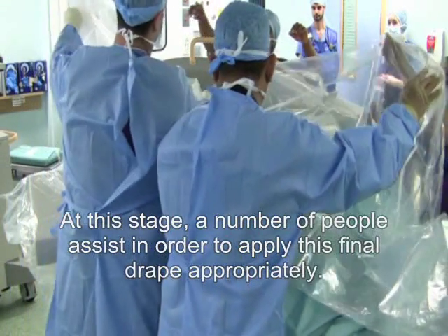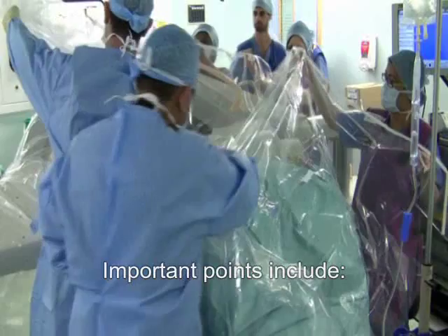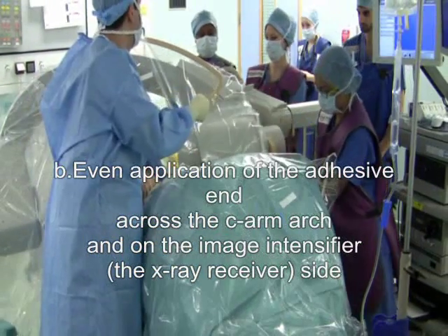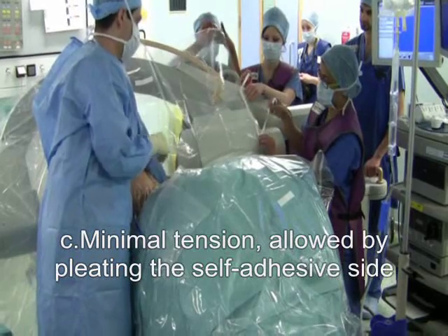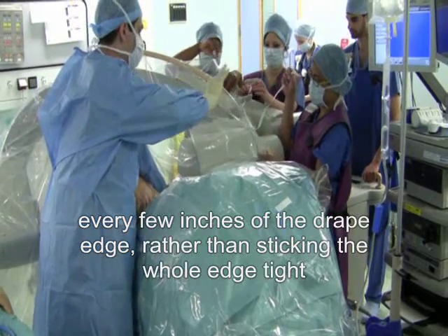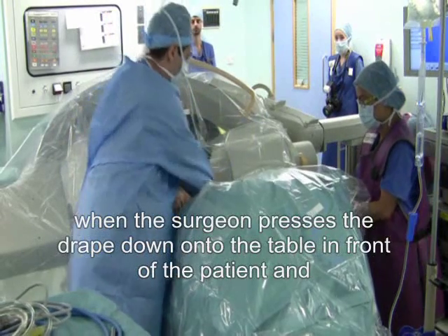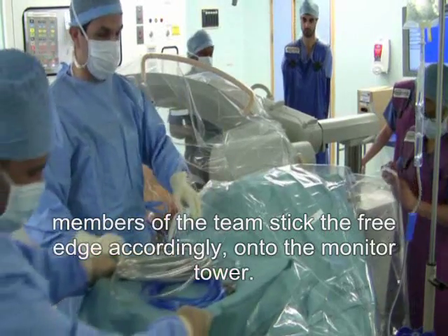A number of people assist in order to apply the final drape appropriately. Important points include: A, a posterior pouch to collect overflow of fluid; B, even application of the adhesive end across the C-arm arch and on the image intensifier — the x-ray receiver side; C, minimal tension, allowed by pleating the self-adhesive side every few inches of the drape edge rather than sticking the whole edge tight; and D, allowing the formation of an anterior pouch for overflow of fluid, where the surgeon presses the drape down onto the table in front of the patient and members of the team stick the free edge onto the monitor tower.